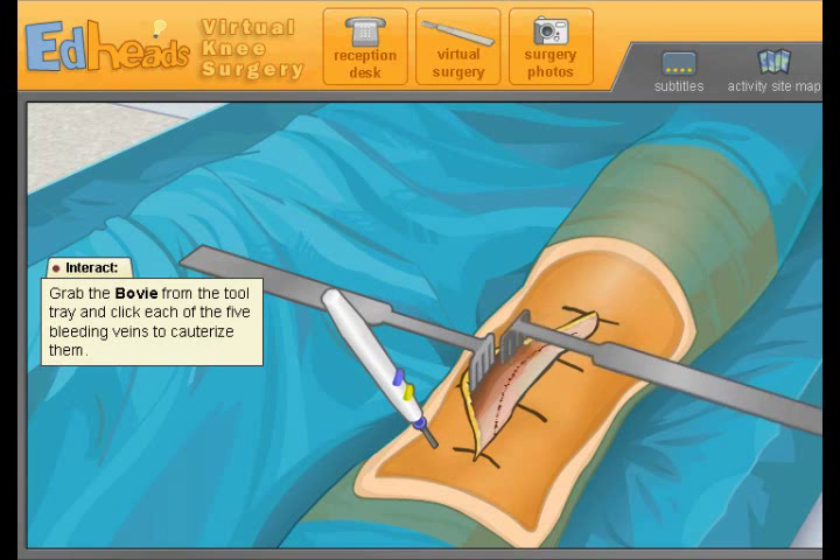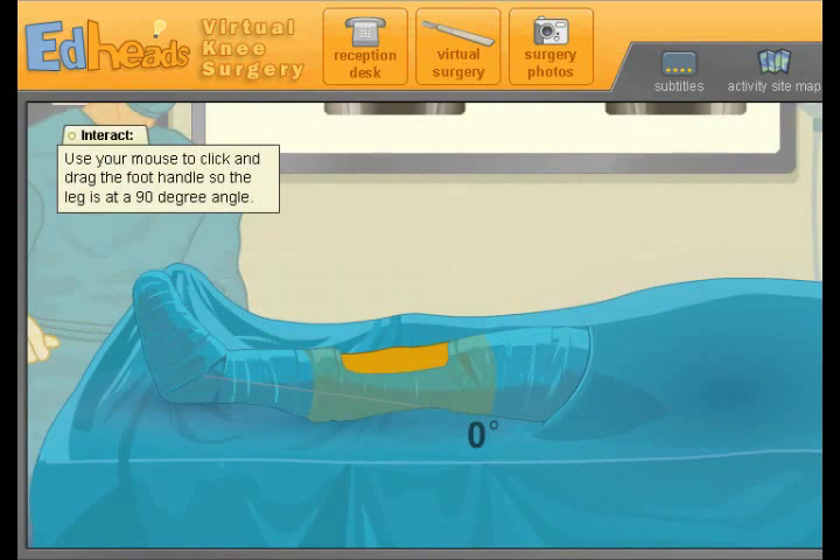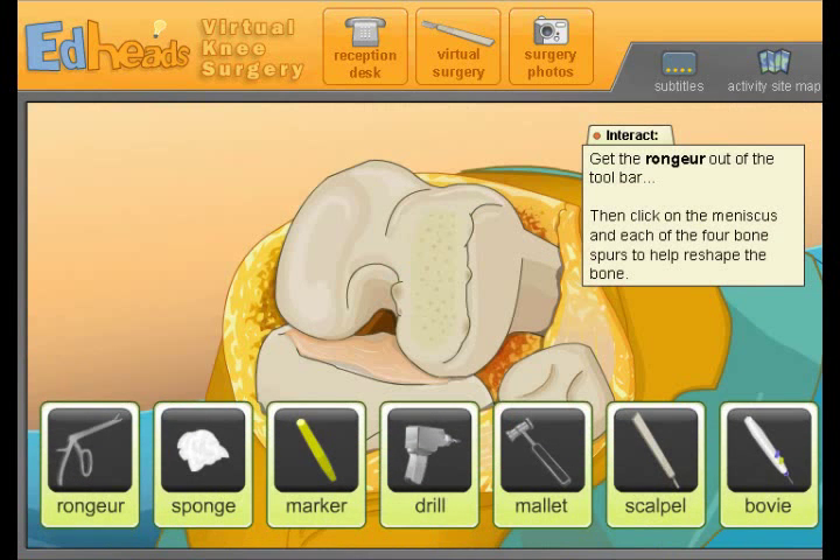The rake retractors fold the skin and tissue out of the way, exposing our patient's knee. To operate, we need the patient's knee elevated and bent so the bones are fully exposed — alright, so it needs a 90-degree angle. Now the leg is at the proper angle. Use the rongeur to remove the anterior cruciate ligament, or ACL, the meniscus, and any bone spurs that may be lurking about.